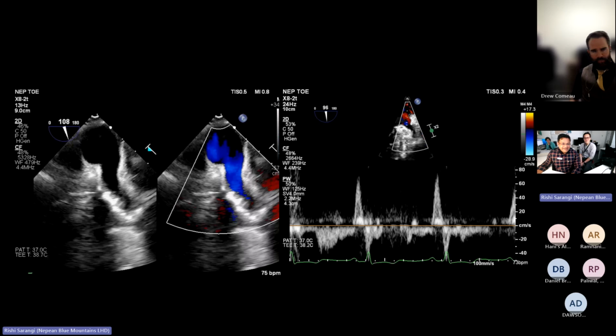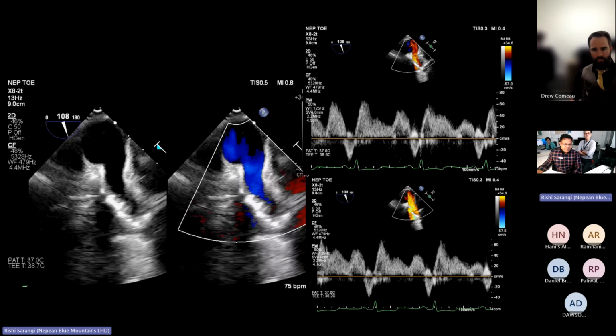So there's the left atrial appendage and the left upper pulmonary vein. They are separated by just the Coumadin ridge. Many times you can often place the probe slightly deeper by mistake, and you can get this waveform. So once you get this, get rid of it, go back to square one and start from scratch again. And this is what we got.